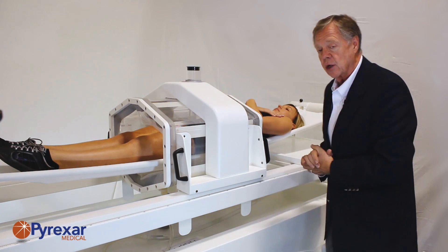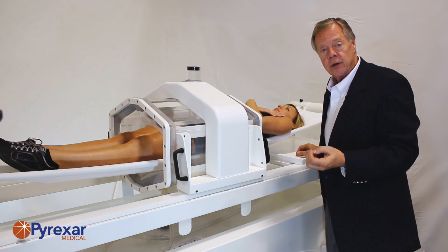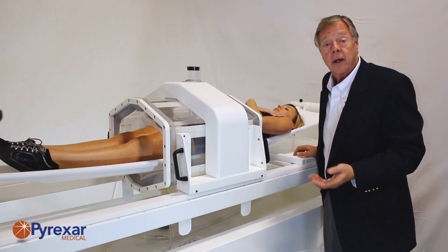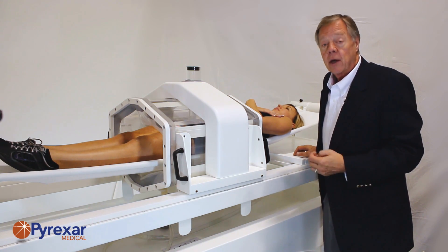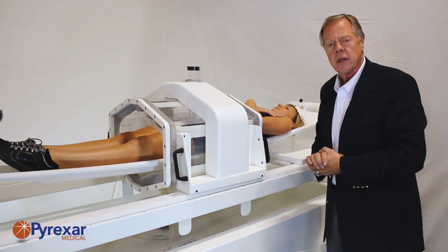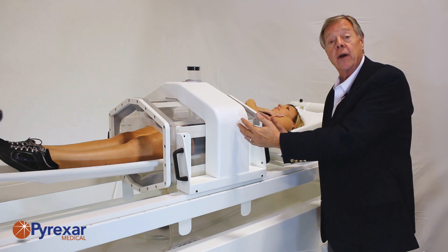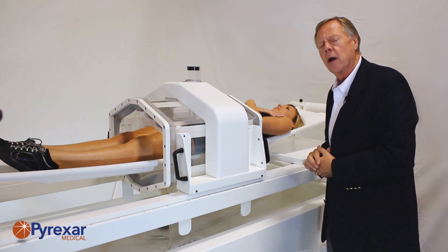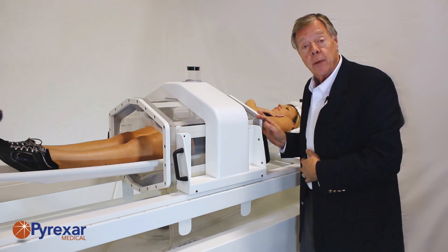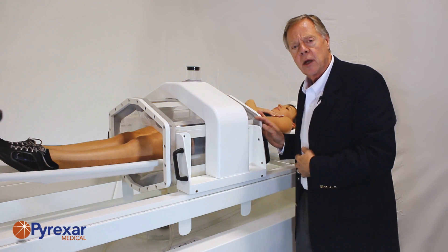This positioning would be used to treat the pelvic area. Commonly we would be treating advanced cancer — prostate cancer in men, colorectal cancer, soft tissue sarcoma, and other histologies common to these sites. Other areas, like the abdominal region, might involve treating ovarian cancer that has spread into the abdominal region. Positioning in the thigh area is also common practice to treat soft tissue sarcomas of the thigh in combination with chemotherapy.